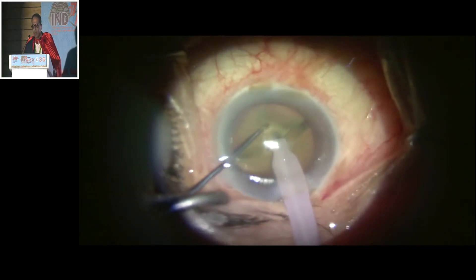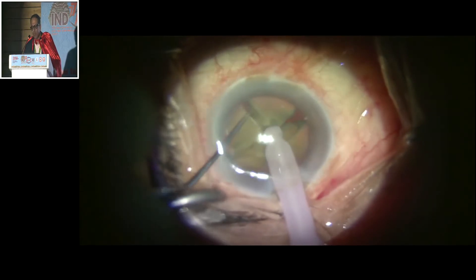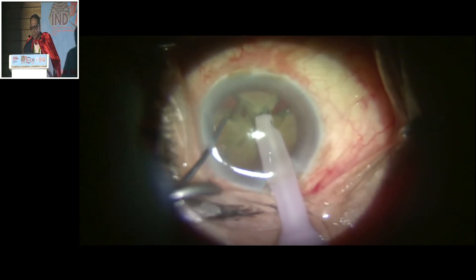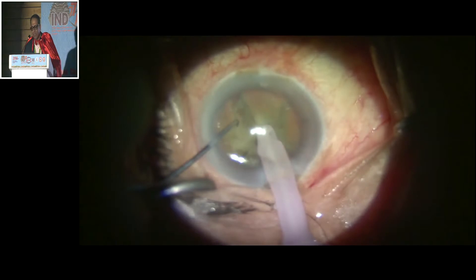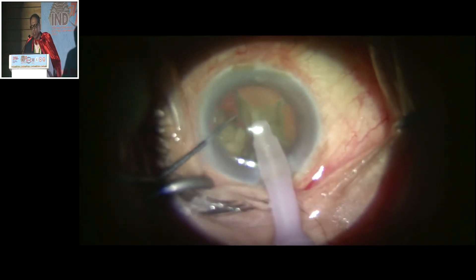Now I know that there is some zonular dehiscence, so I am going to keep these nuclear pieces in place because this hard nucleus will be used as a scaffold for the first time.